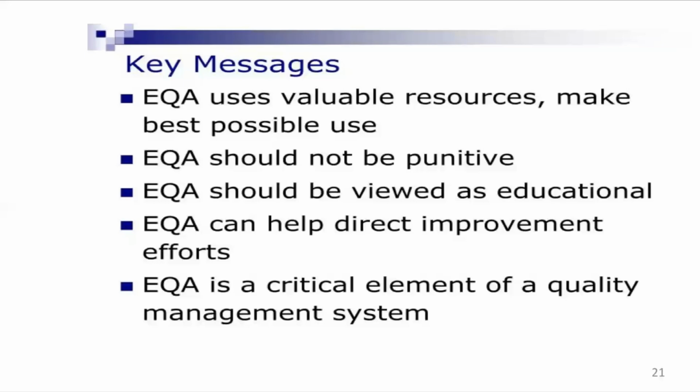Find out the purpose. And the person who is running the sample, if there is some outlier, do the root cause analysis and take appropriate action. The person shall not be punished. It is a learning process. Over a period of time, when you know these are the possibilities of variation, you take care of all these things, so you feel more confident in your laboratory.